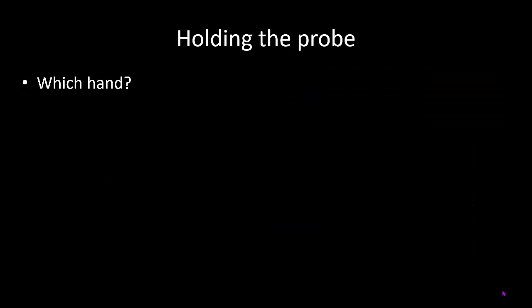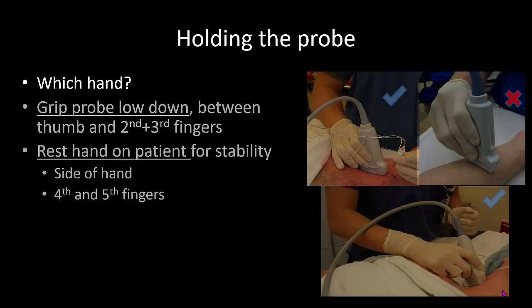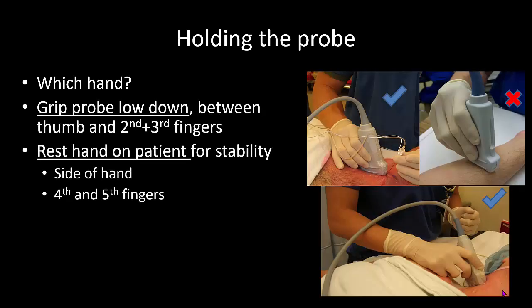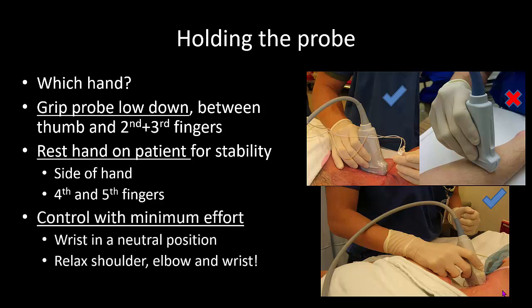The way you hold the probe is also important. You should use whichever hand feels most comfortable, recognizing that you will be using the other hand for needling. A common mistake is to hold the probe high up, when what you should be doing is to grip it low down and have part of your hand resting on the patient for maximum stability. With practice, you want to get to the point where you can control the probe with minimum effort. This means having the wrist in a neutral position and relaxing your shoulder, elbow, and wrist.